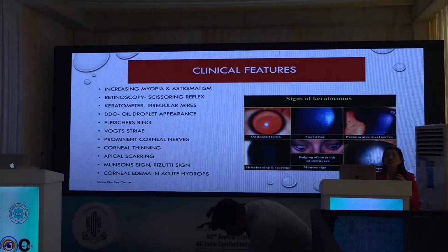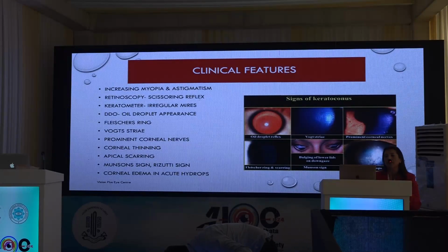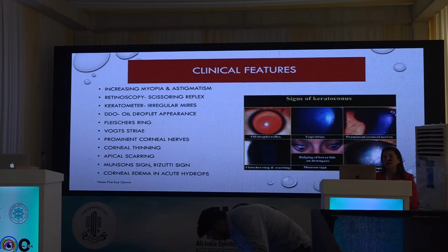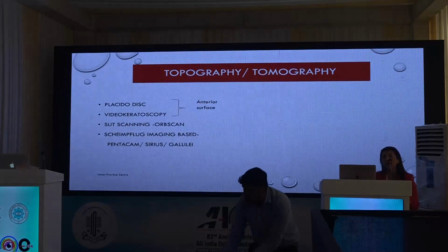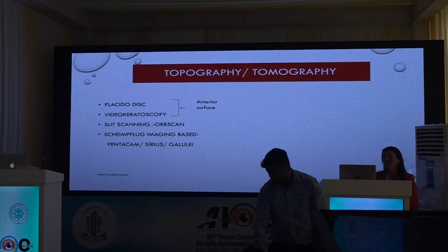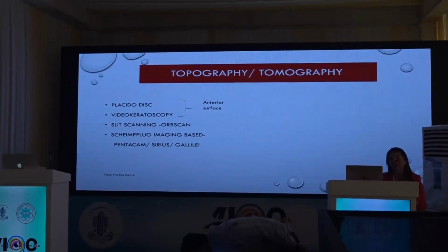Now, these clinical features of established keratoconus, we've all been very familiar with in our undergraduate days, postgraduate days. And it's not that we always see these cases at an advanced stage. I think it's becoming a little less. But what we need to do is diagnose it as early as possible. So one of the important diagnostic modalities that we have has been the topography.